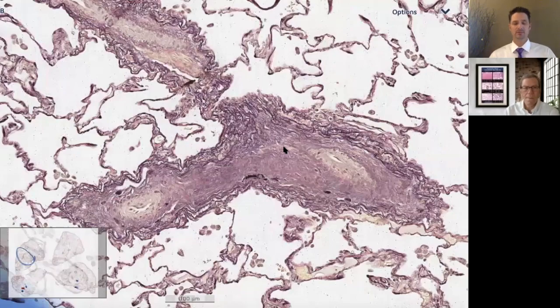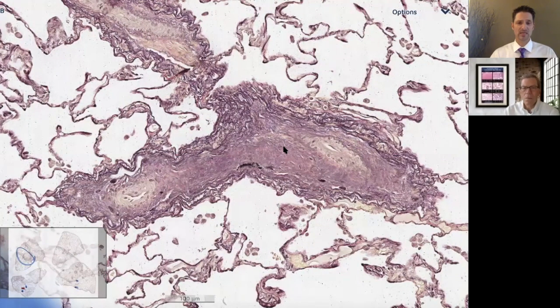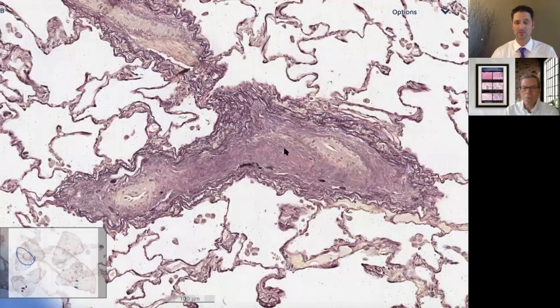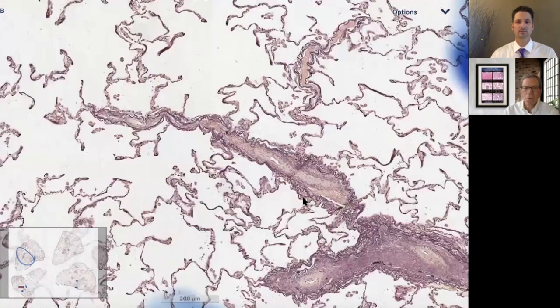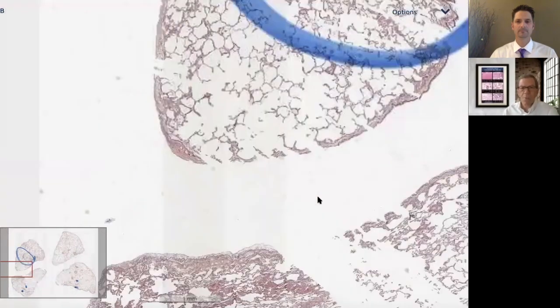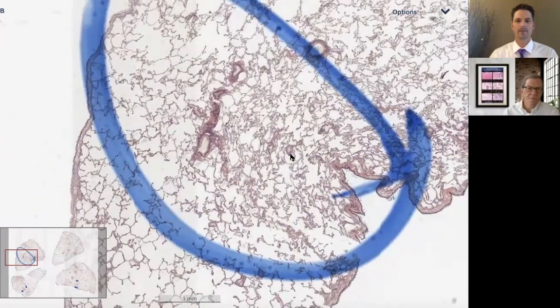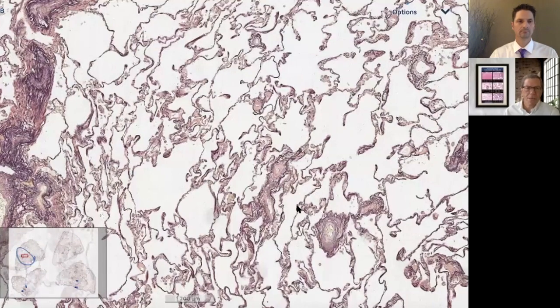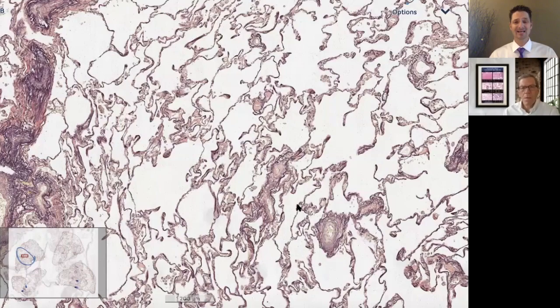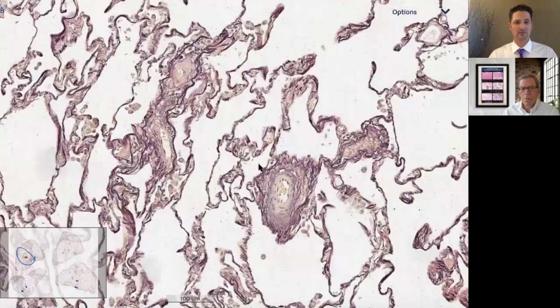In fact, you would say these venules are completely occluded — 100% occluded. This is an amazing case, the kind you save and photograph for a textbook, because most of the time when this diagnosis is being questioned the changes are so subtle you have trouble even finding pulmonary veins. This is the poster child case for this disease process. Looking around the rest of the parenchyma, we didn't find any evidence of the partner lesion that occurs with pulmonary veno-occlusive disease on occasion — pulmonary capillary hemangiomatosis — which was not seen here.